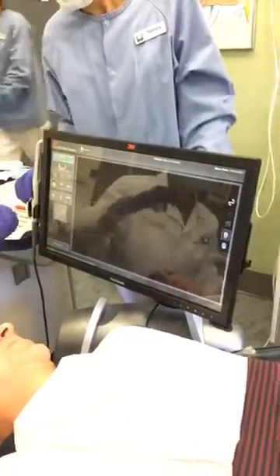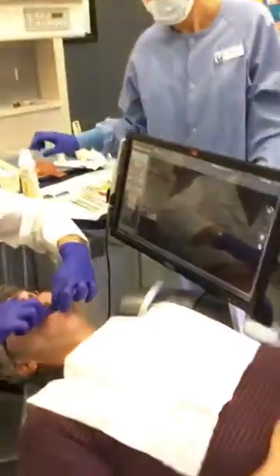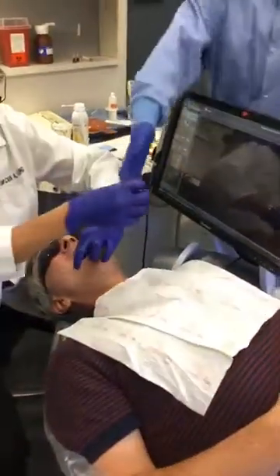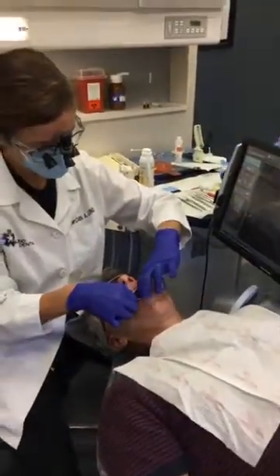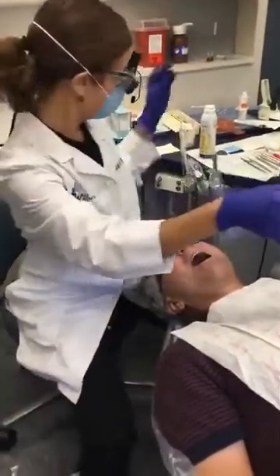So now we're going to scan the opposing — so we can take out the stuff on the bottom. Opposing meaning upper. The lab needs to see top and bottom so they can do the bite.